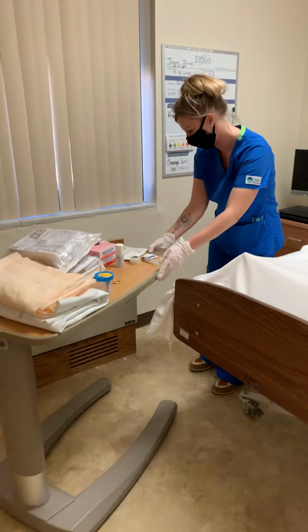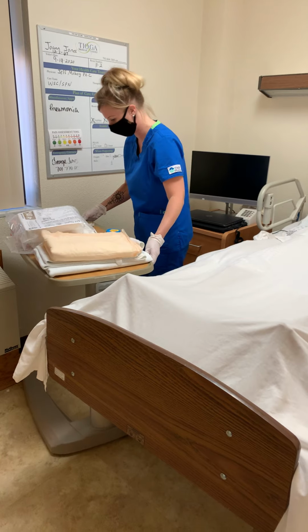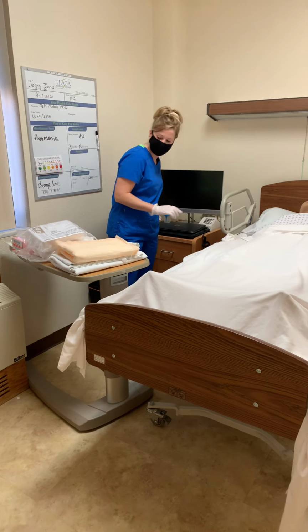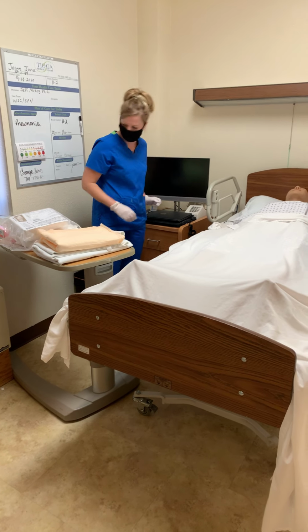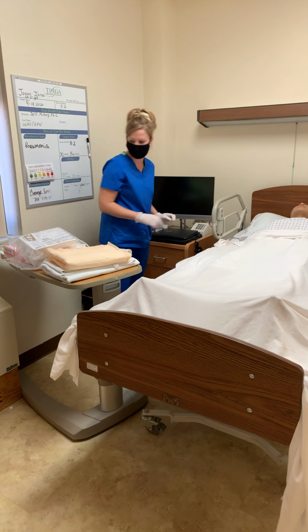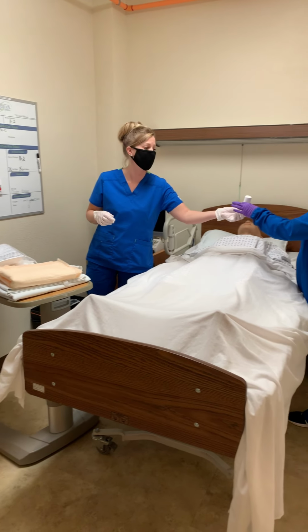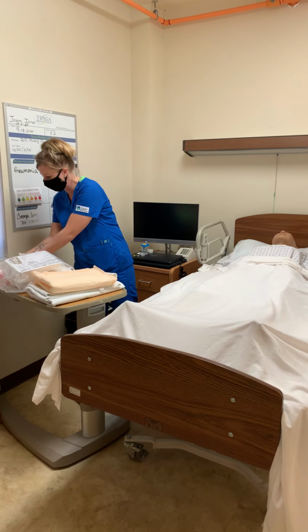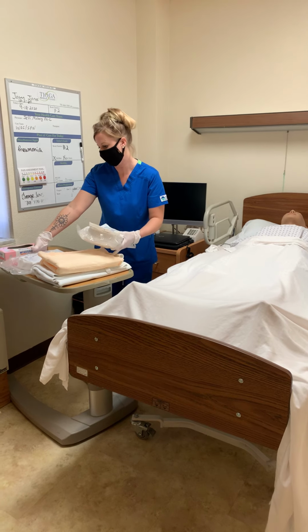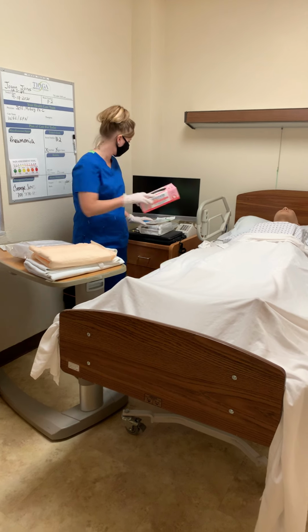Okay, so I have an extra sterile catheter if needed. I have an extra set of sterile gloves if I break sterile field. I'm going to set my urine specimen cup over here because I need to grab that after. Okay. I'm going to set just the rest of my supplies out of the way. I have lube. It comes in the package, but because Joanne can't take regular lube, we're going to set it aside. So, set this aside and this aside for just in case.